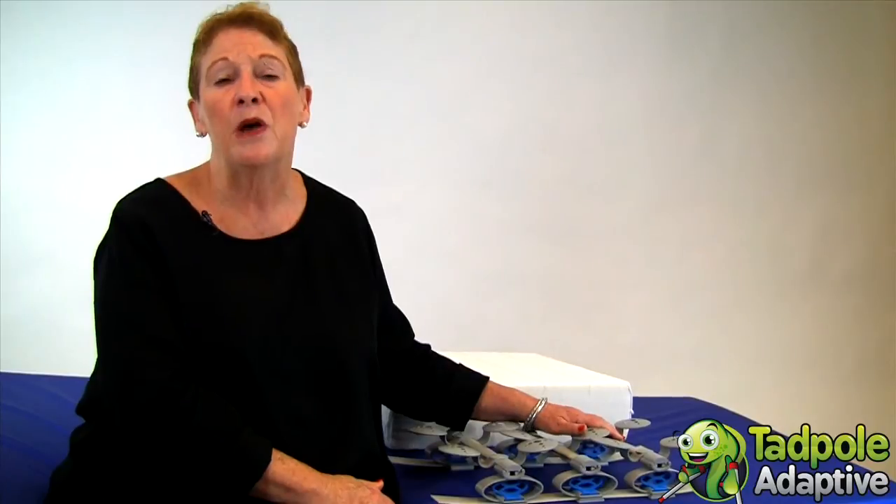The Sleeping Star can fit on any standard hospital bed or any standard twin bed frame. If your child is still tiny and sleeping in a crib, we also have crib-sized Sleeping Stars.